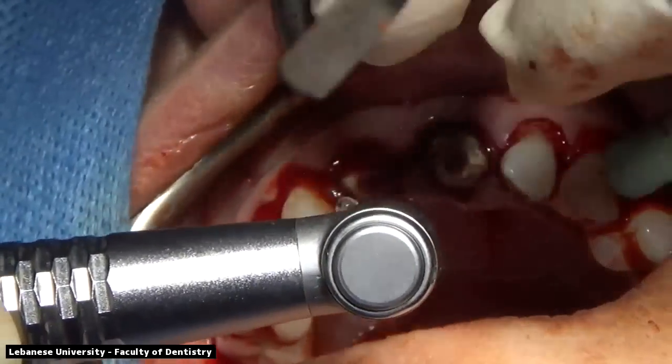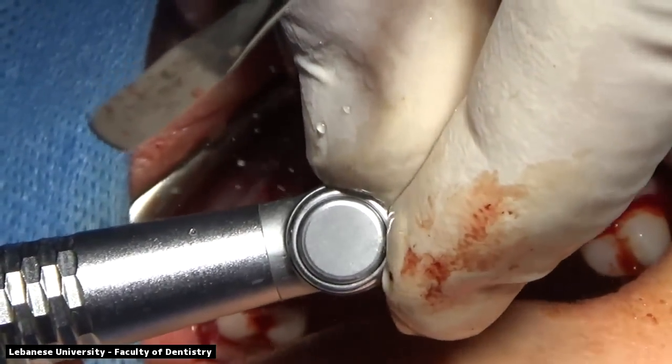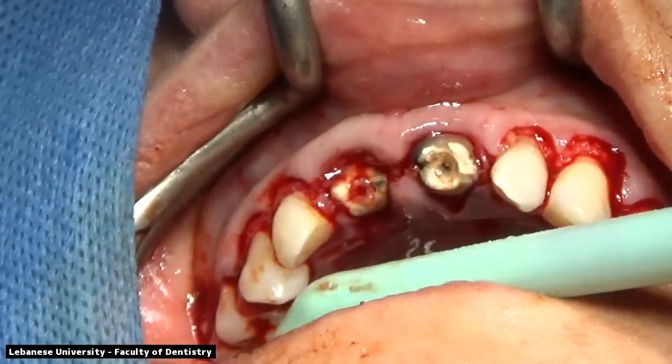So just making sure that there is enough irrigation and water so that we do not overheat the bone and create necrosis.